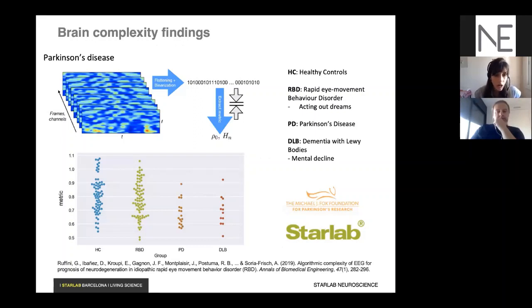So what we did here is we started from the spectrograms of the EEG signals. To estimate the Lempel-Ziv complexity, you can start from the spectrograms, you can even start from the single EEG epochs, or you can even start from extracting the envelopes. The important thing is that you need to binarize your sequence, wherever that may be. The best binarization criterion to our knowledge is the median binarization, because this way we get rid of the outliers, and it's not sensitive to power changes. So let's say that we threshold our spectrograms with respect to the median values, and then we assign the value 1 for the values that are higher than the median, and the value 0 for the values that are below the median. And then we come up with a matrix that only has ones and zeros. We enter this into our algorithm, and then we get the final complexity measure.